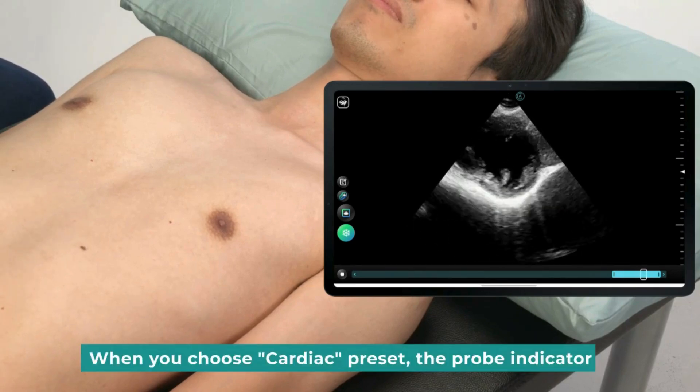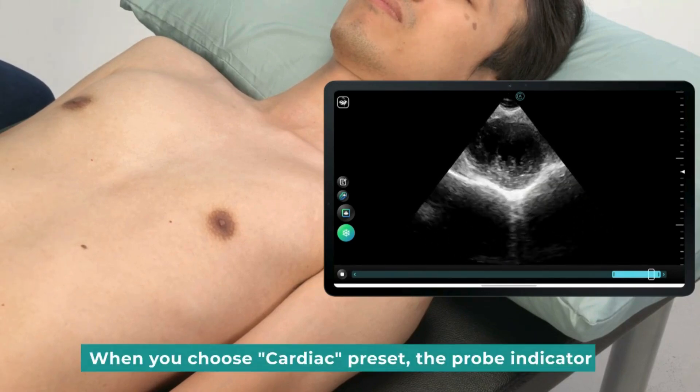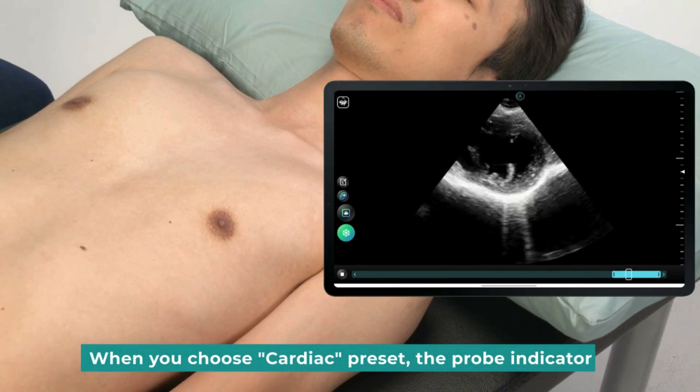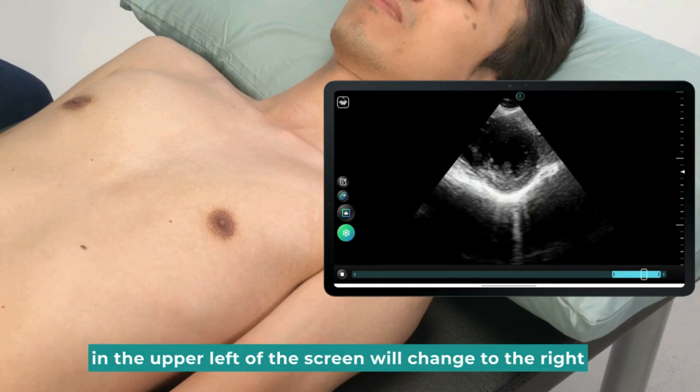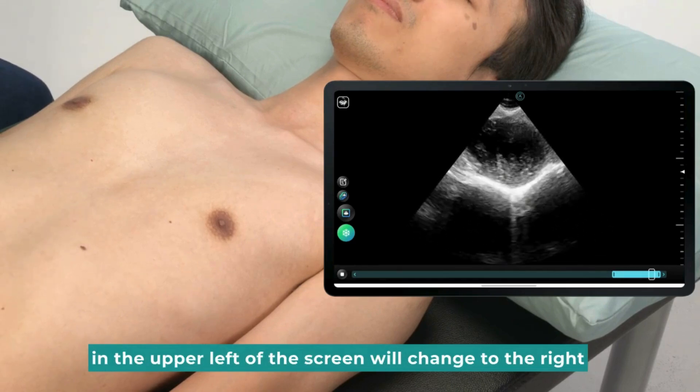When you choose the Cardiac preset, the probe indicator in the upper left of the screen will change to the right.